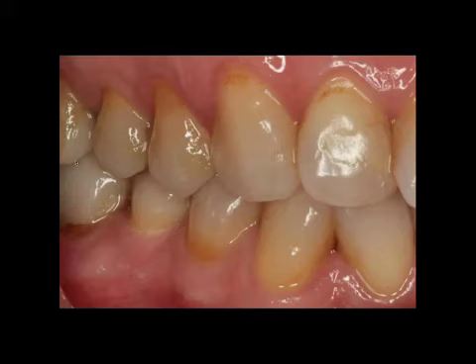It's not, even if we do get a little bit of recession around these implants and we see a little bit of white, if that is what the future is holding for me in 10 or 15 years, I'm not going to lose sleep over that. Whereas if I have the same issue with, let's say, a one-piece titanium, which is not used, but a two-piece implant, if we start seeing some of the metal, it is something that's difficult to deal with.